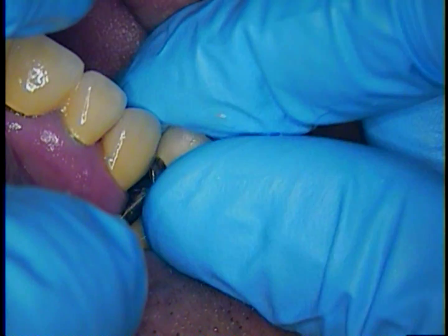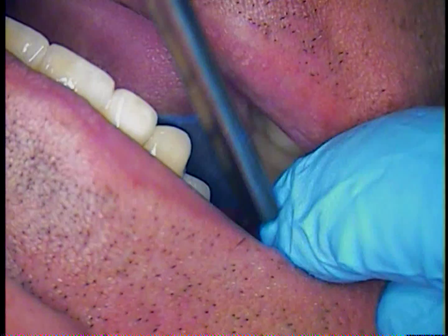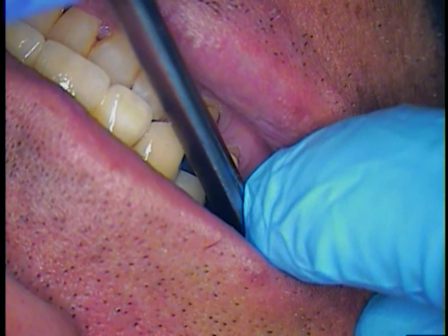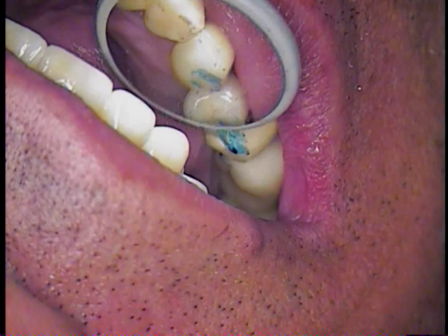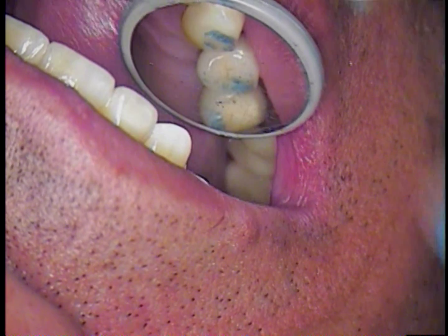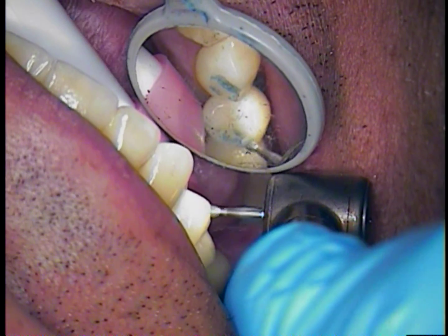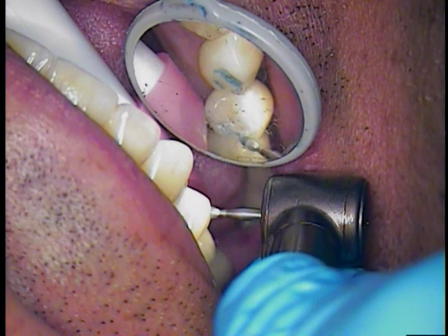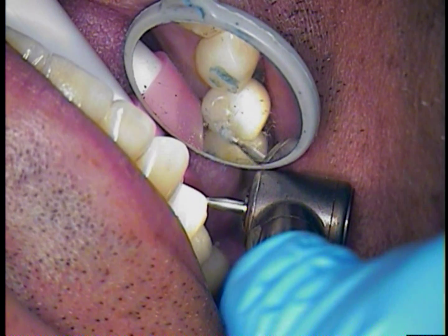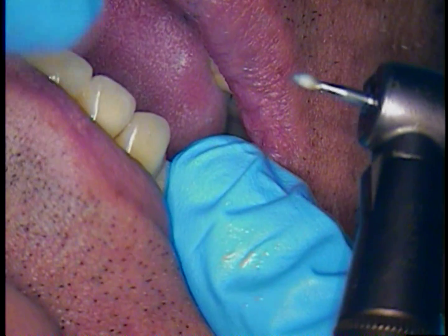Back in the mouth. We have not torqued the abutment down, so I am going to go as far as I can with adjusting the bite, and then after I cement it I will check it again. The abutment has been hand tightened. Now I am going to do a little bit more adjusting near the cusp tip and the distal line angle, just to see if we can slow the movement down a little bit more.